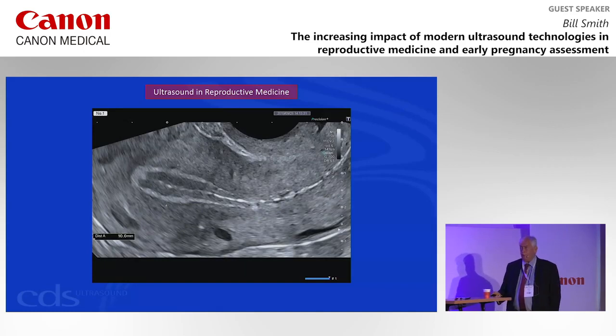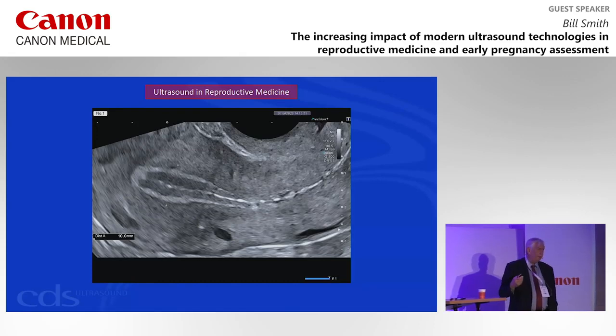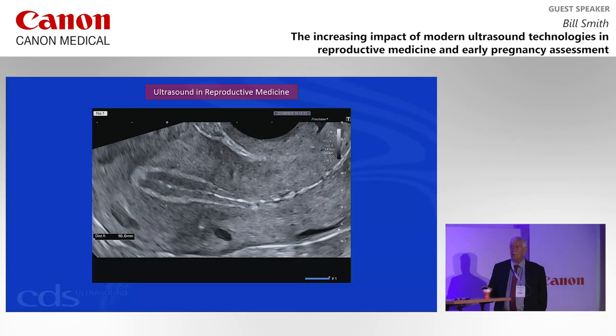If we go to this endometrium, this is a patient who's about to go off and have an egg collection. This is not a good endometrium. That lady was given a trigger injection on the basis of this endometrium, and she didn't conceive, which comes as no surprise to us because you can see it's flat. There's no element there of glandular activity.